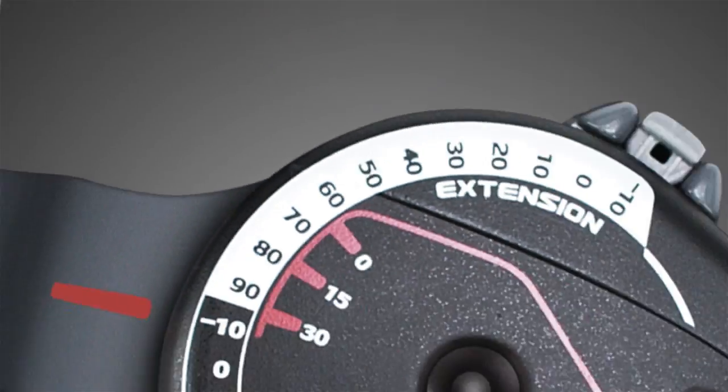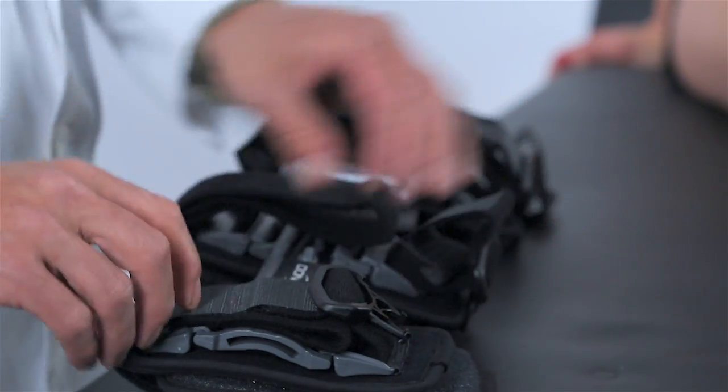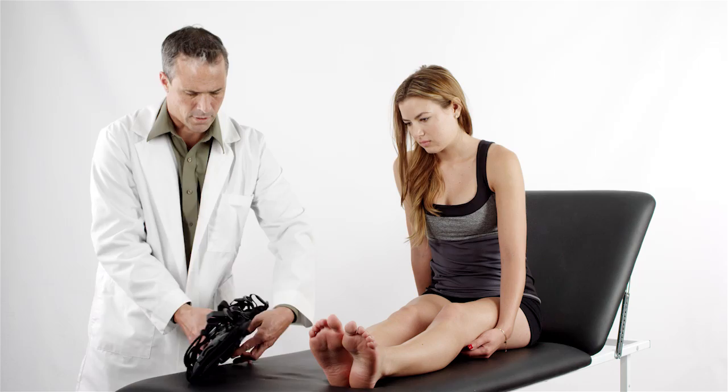To discover the adjustable features of the Exact ROM brace, unfasten the strap ends near the black buckles. Open the brace flat to its widest position by pulling both of the uprights apart.